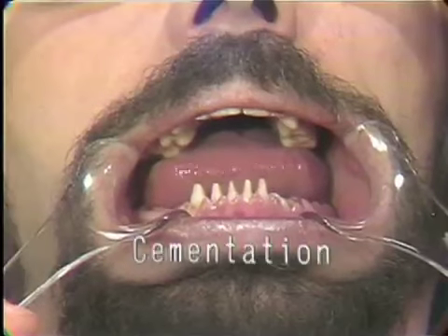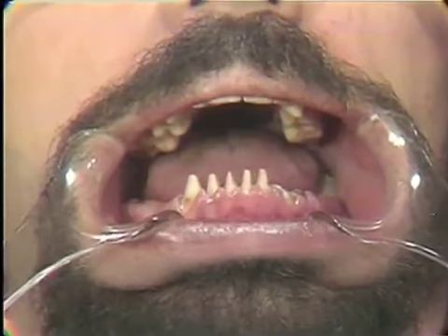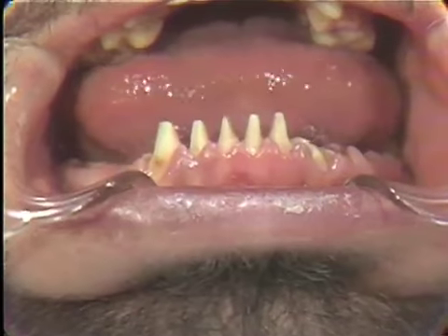Again, we're dealing with multiple temporaries. The idea behind the cementation procedure is to get all of these temporaries in the mouth without having the temporary cement all over the teeth, all over the mouth. It's quite a procedure for cleaning up the mouth after the temporary cementing procedure. So now we will go through the proper way of cementing multiple temporaries. The cementation of the temporaries is an important aspect in maintaining the stability of the teeth in that position during the time that we're fabricating the final restorations.